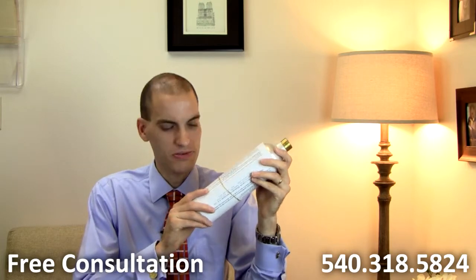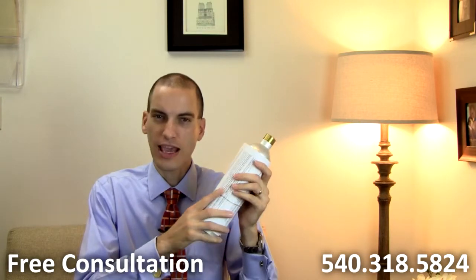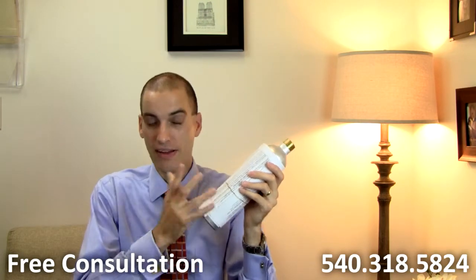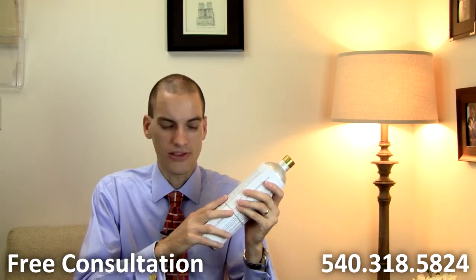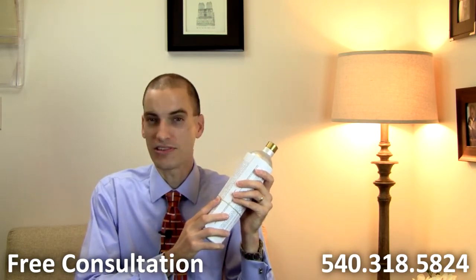You'll note that this cylinder has some papers around it. What are all these papers? Well, this is the way it actually came from the lab. The lab who produced this for us, it actually comes with this certification that says that this cylinder is comprised of 0.08% alcohol and nitrogen, and that's the only other component. And it actually has an expiration date on it. This one happens to expire in 2017.